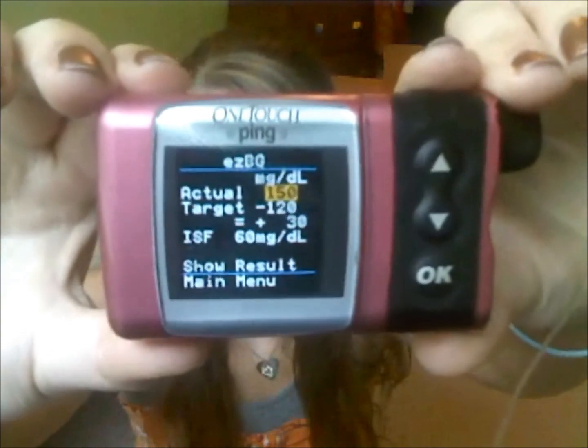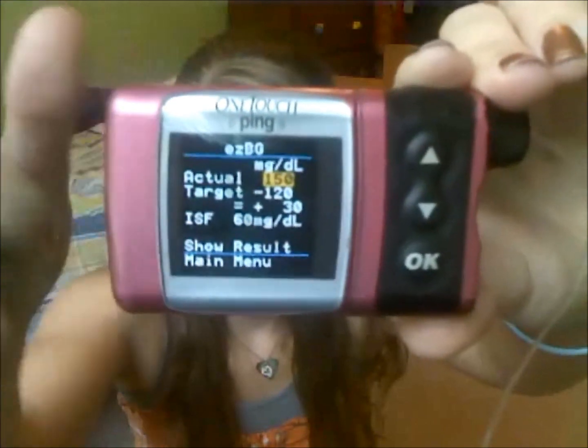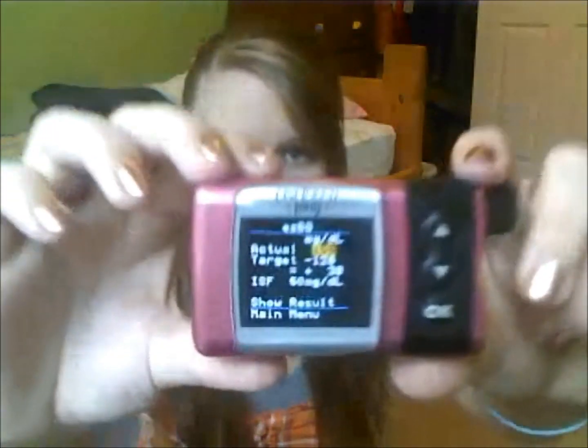As you can see, it takes the number that you are, which in this case is 150, minus your target, and mine happens to be 120. And then it uses the ratio of how much 1 unit lowers your blood sugar. So for me, 1 unit lowers me 60. And so it uses that to calculate how much more insulin to give if you're high, or how much less insulin to give for your meal if you're low. If you're low and you're bolusing for other stuff, it can subtract how much you don't need to bolus because you're low.